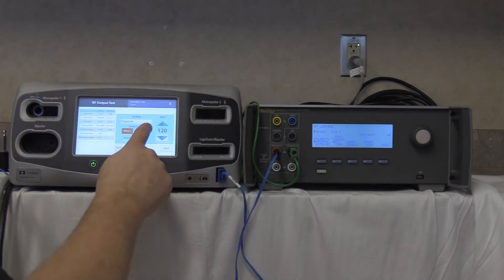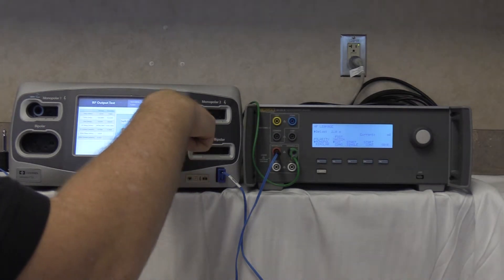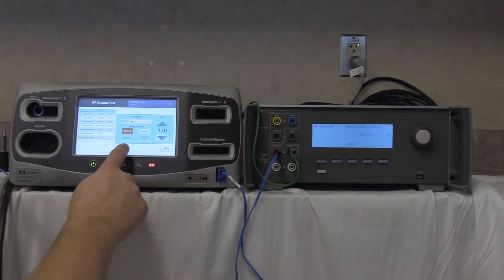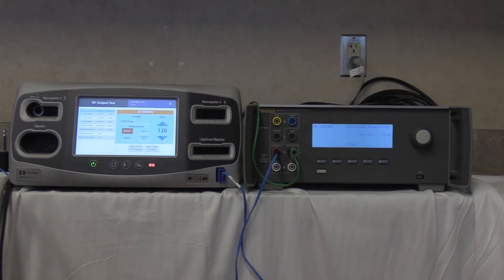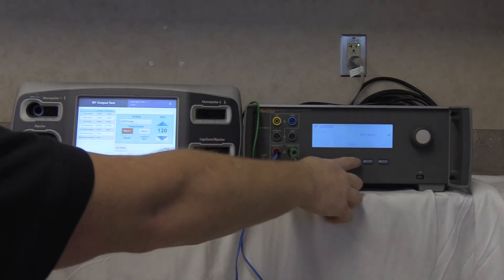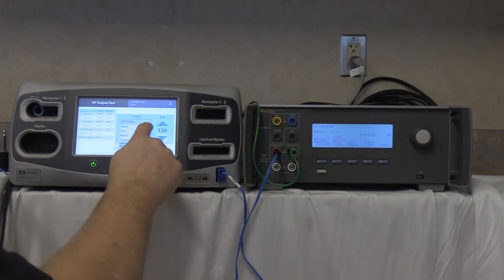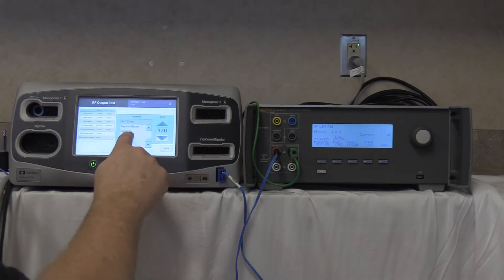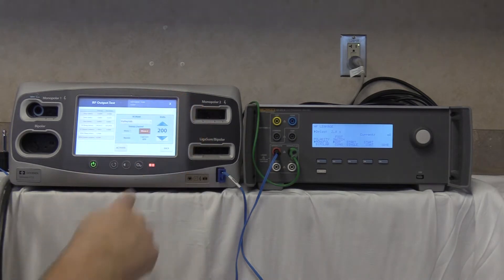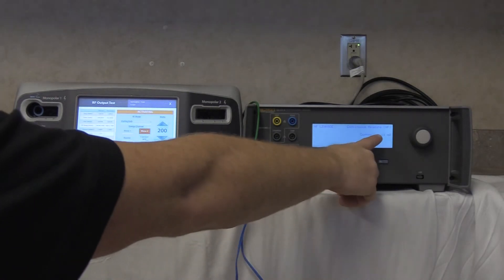Next, soft coag at 120 watts. Start continuous on the QAES-3 and activate the FT10. Reading is 15 milliamps. Deactivate, no-hold, stop. Next, ValleyLab 200 mode. Start continuous and activate. Reading is 61 milliamps.